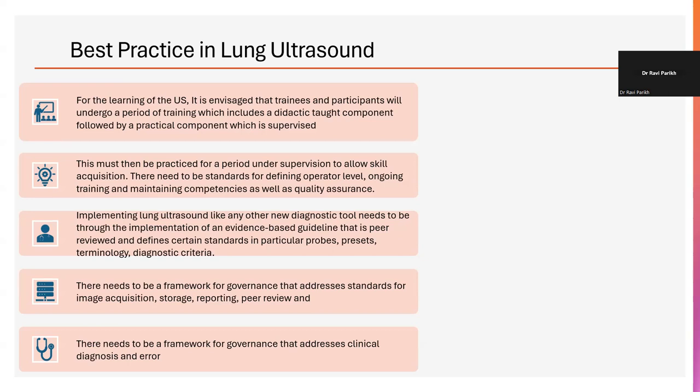So if you have that kind of a framework in place, it just means that you can practice lung ultrasound safely, whilst colleagues who don't use lung ultrasound, naturally not everybody is comfortable using point of care ultrasound. And we need to respect that. We need to respect that in a manner that makes them feel comfortable about our abilities. We need to make sure that we take them along with us.